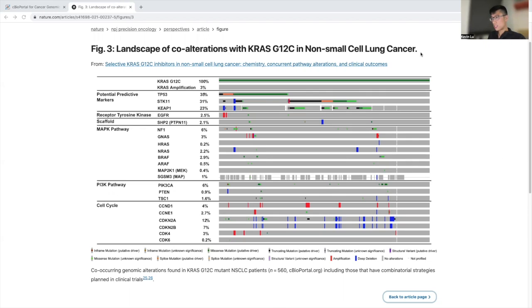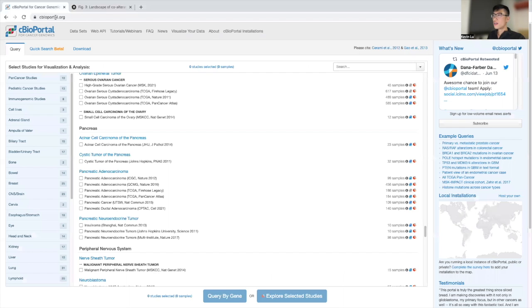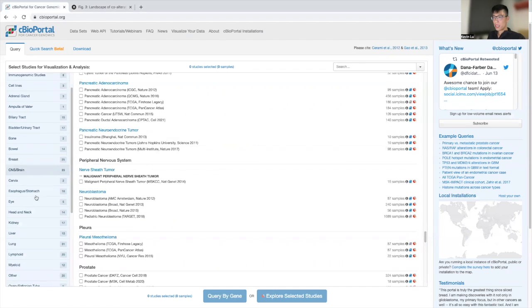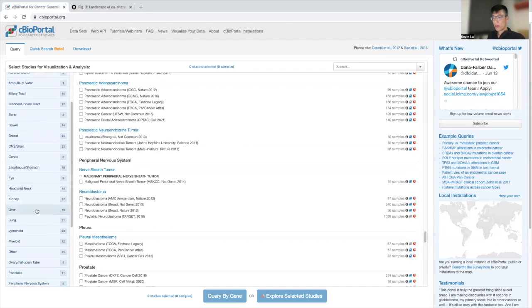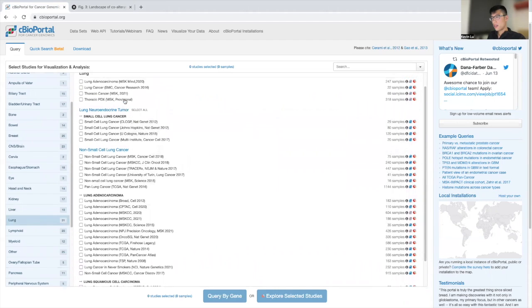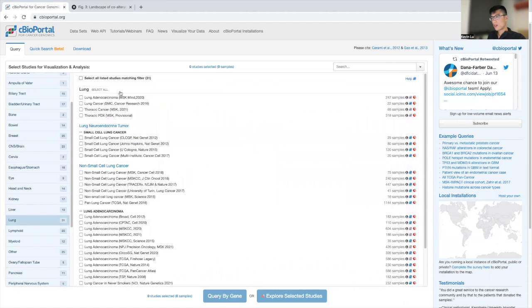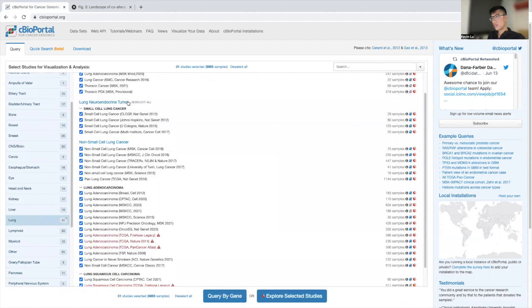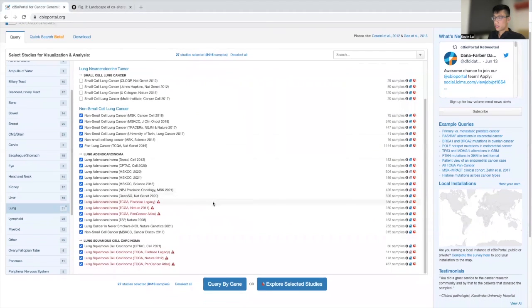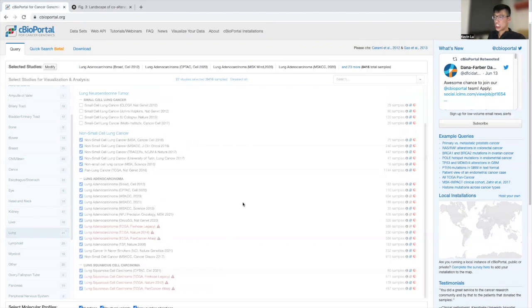So I'll recreate this oncoprint. Loading up to the regular cBioPortal, we're going to look at the studies that we want to take a look at. We're going to select all, deselect small cell, and going to hit query by gene.